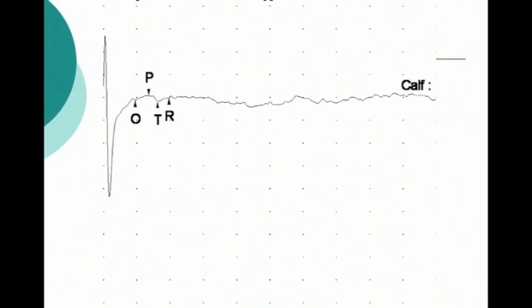Here's another low sensory response, but it's still present.